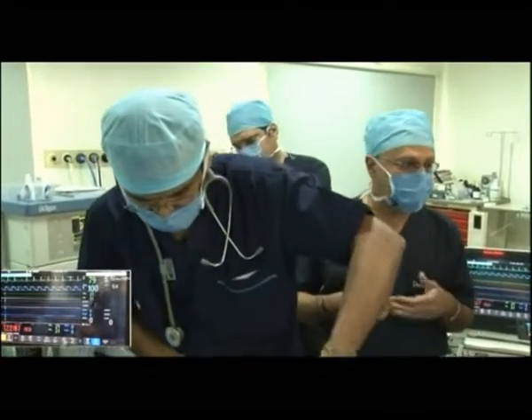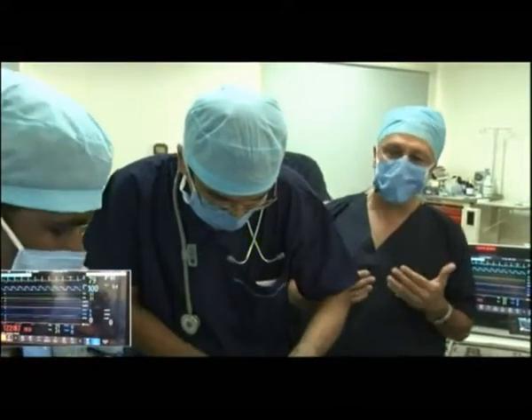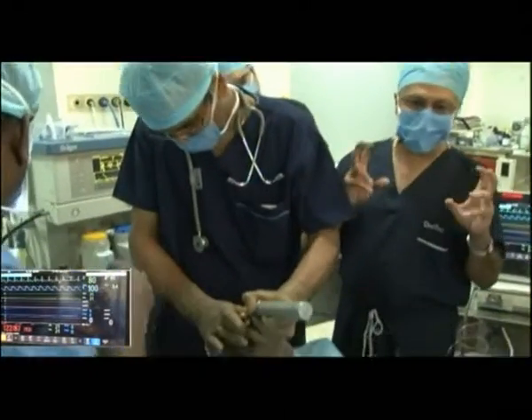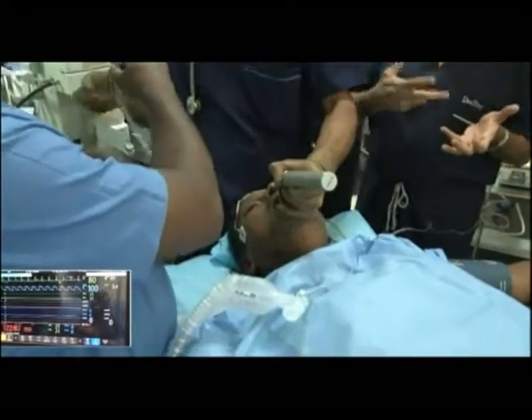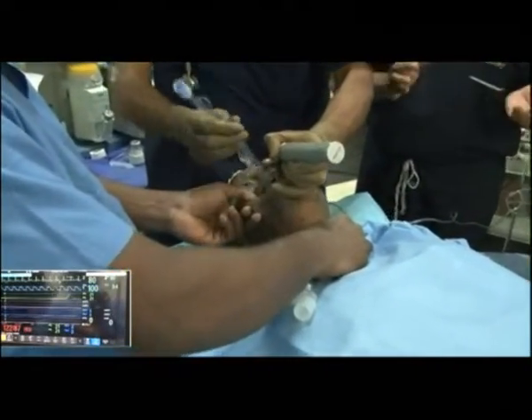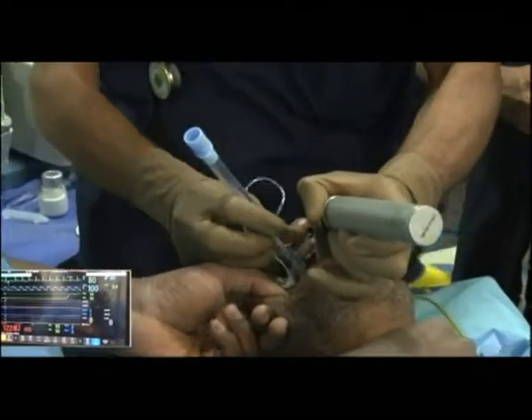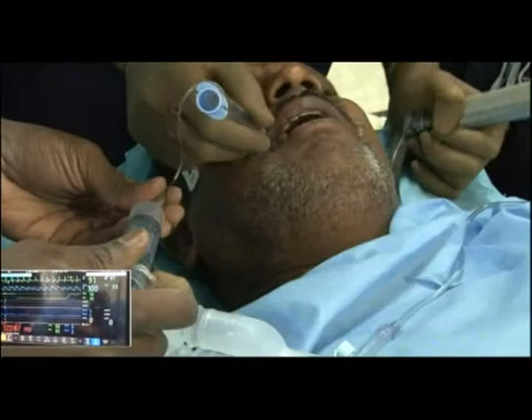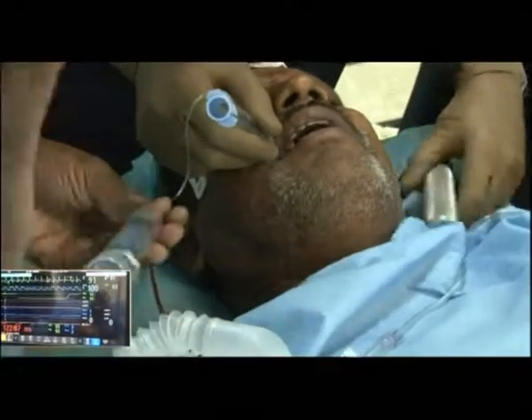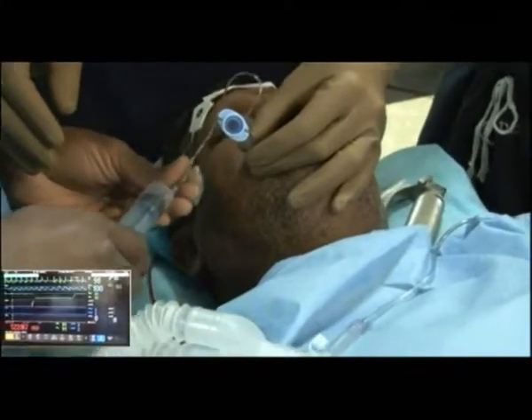After that, we give muscle relaxant. Again, comparing old times with new times, in the old days, we used to do what's called a test dose before giving the muscle relaxant. You basically attempt and see if the patient can be ventilated. We do not do that anymore. In fact, it's not necessary and there's more harm to the patient. So we don't do a test dose of bag ventilation.